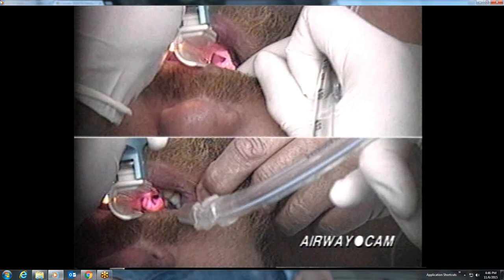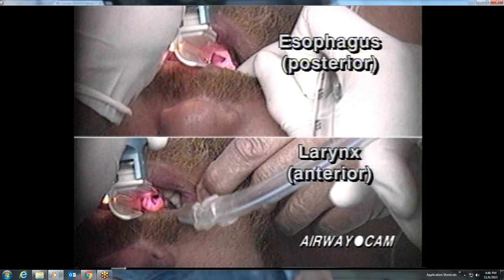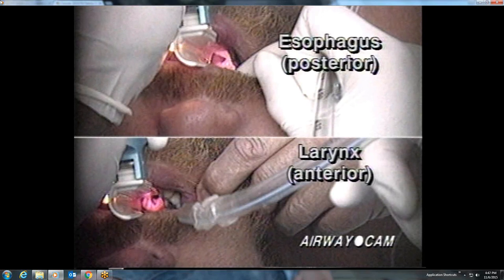This still shot provides a comparison of the esophagus and the larynx. The entrance into the esophagus is a very round hole without structure, located posterior to the larynx and slightly to the right of midline. The laryngeal inlet has a three-dimensional appearance created by the posterior cartilages, interarytenoid notch, and the aryepiglottic folds.